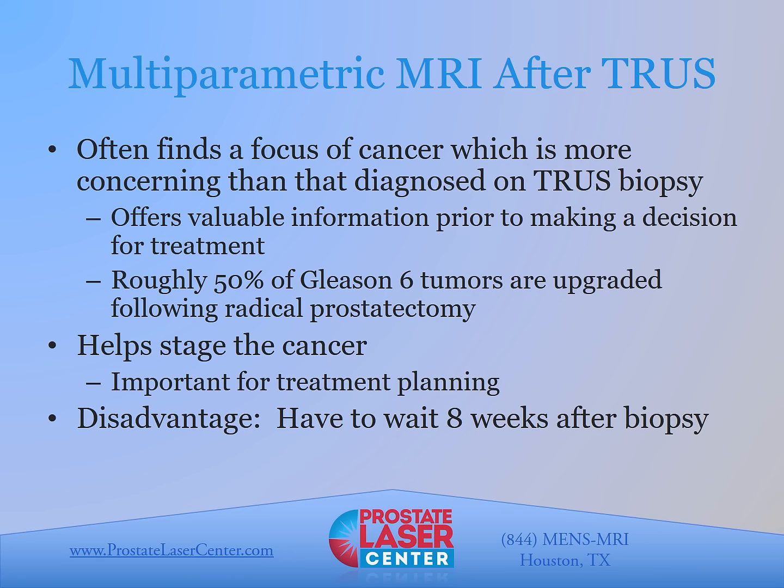in terms of being good candidates for active surveillance, or if they see a lesion on the MRI that's more worrisome, that does not correspond with what the pathology findings were, then a needle can be placed using a targeted biopsy of that other lesion in order to determine if they really are a low-risk patient or not. Furthermore, it can help stage cancer, which can be important for treatment planning.